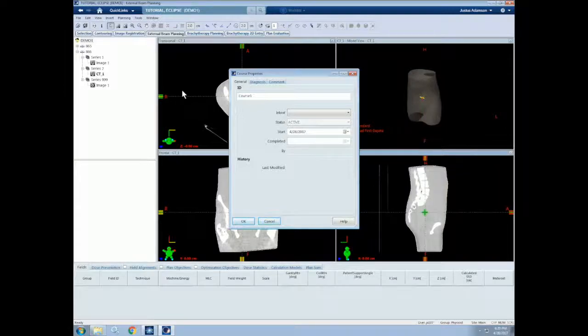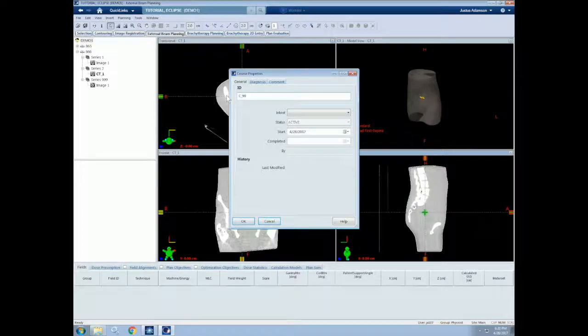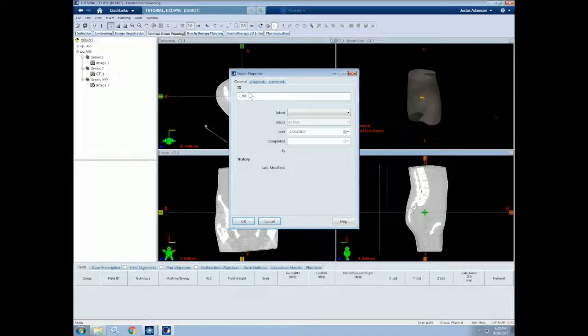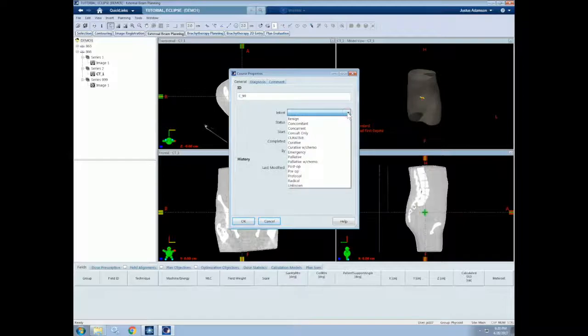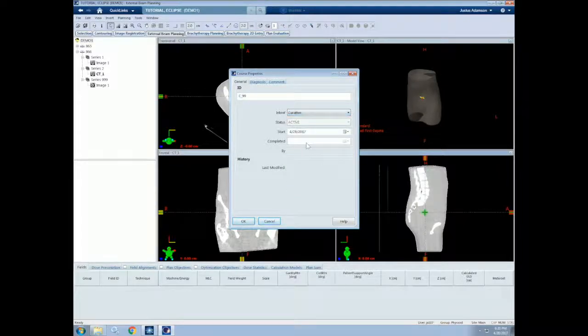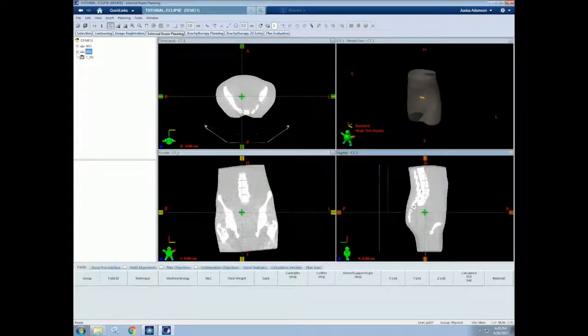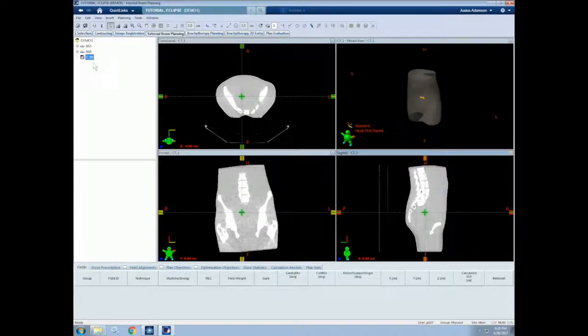They should be descriptively named to avoid treatment confusion. For this tutorial, let's name our course C99. This is usually what we call a research course. We can then set our intent. For now, we'll choose Curative and then select OK. So as you can see now, our course will pop up on this left-hand side.